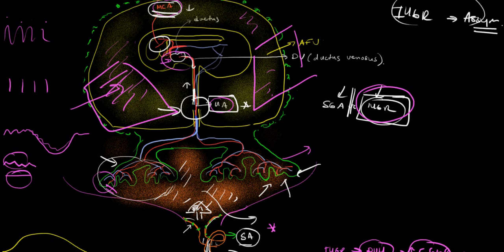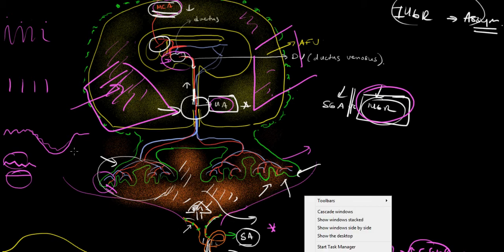And that notion was important in obstetrics, and it led them to start to do something called a contraction stress test. And mothers were given oxytocin to make the uterus contract, and the obstetricians would look and see, did you get this deceleration? And that was said to be a test. It's almost like an exercise treadmill stress test of the baby, and it was a test of placental reserve. But because it involved administering a drug to the mother, and even though it was very safe by what the epidemiology says, it would be better not to do that.